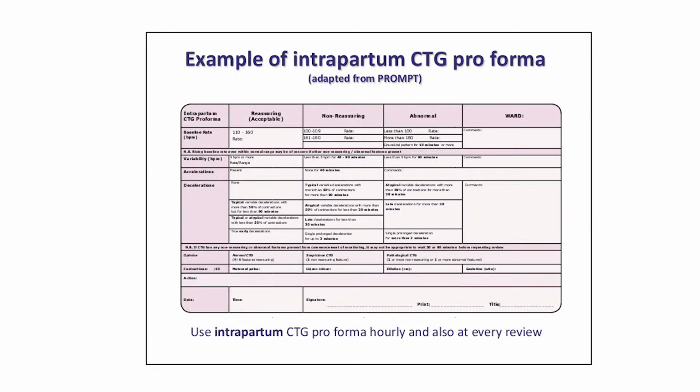And it goes on then to say, so this is an example. I'm sorry you can't see this, and you probably won't be able to see it very well in your handout, but let me explain briefly. In one of our hospitals, we've taken the criteria and said, let's make it easy for clinicians. So this is a sticker. It's about this size, and it goes on the mother's records.